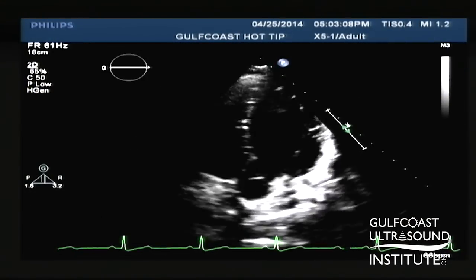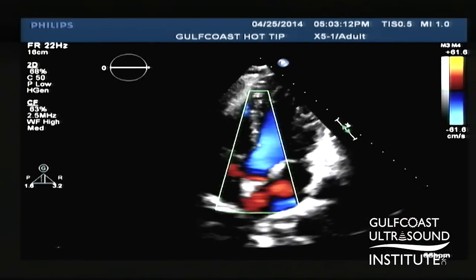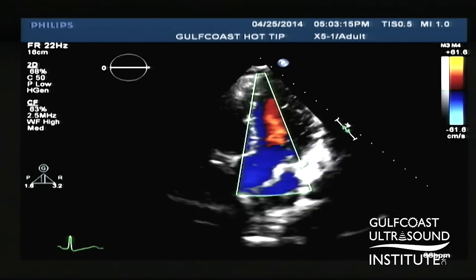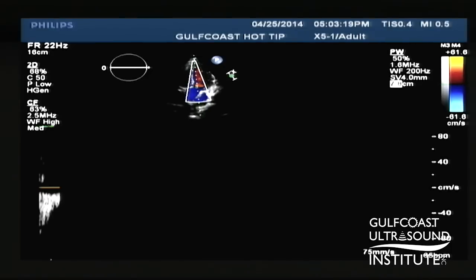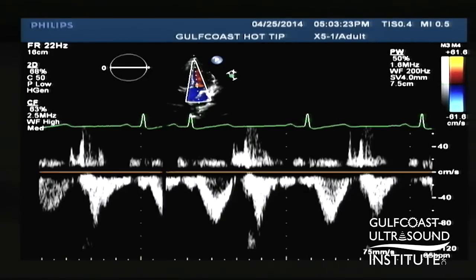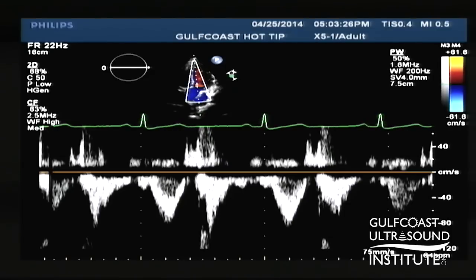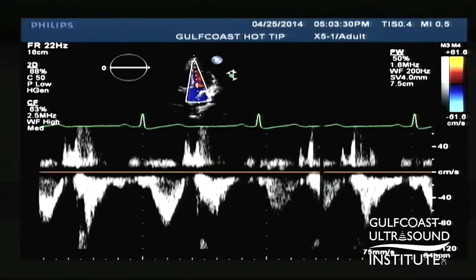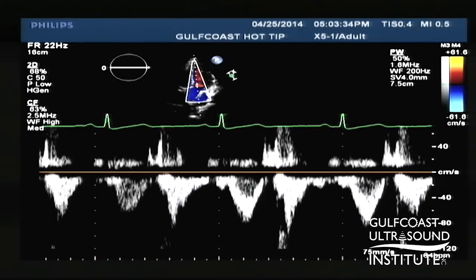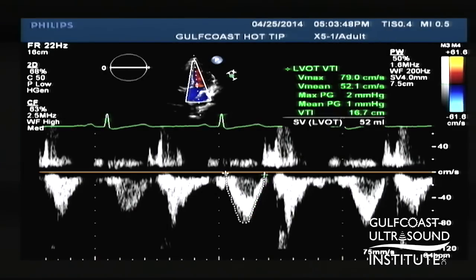The next thing we want to do is get a velocity, or VTI, of the left ventricular outflow tract. So we put on color and pulsed-wave Doppler, and we want to make sure we trace the waveform starting from the baseline to get our VTI. When I trace it, I'm getting a VTI, a max velocity, a mean velocity, a max and mean pressure gradient, and also the stroke volume of the LVOT, which some doctors are going to find really important.